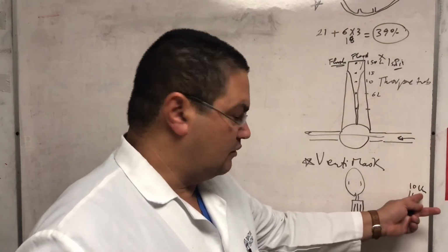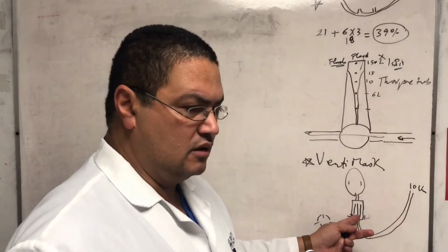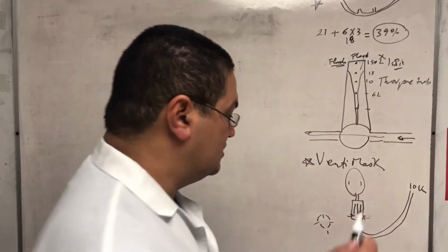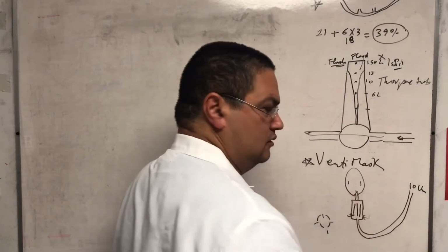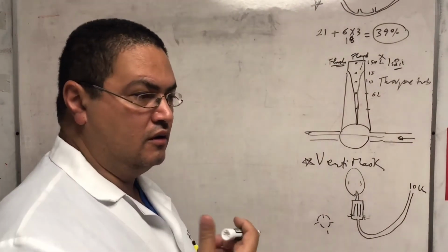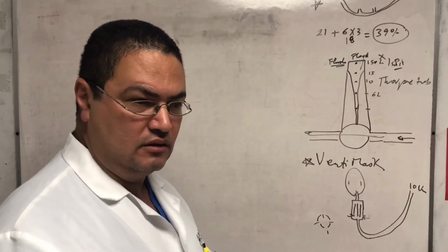One of them is the amount of flow that you're starting with, and the size of these holes. So that's why they can tell you from 4 even. But that's true only here. The mask is loose. Patient can entrain from here too. Patient effort can affect how much entraining can happen.